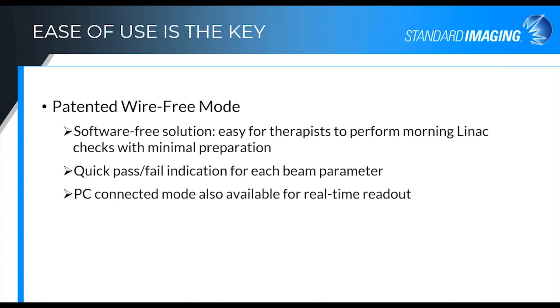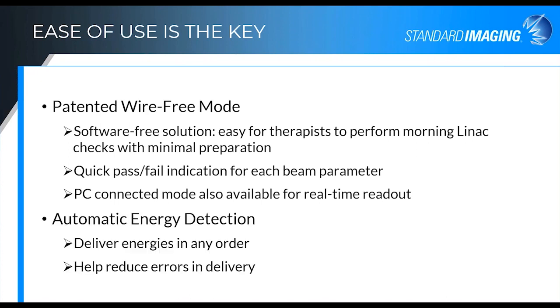If you do want a PC connection and to get real-time measurements, there is also a parallel real-time readout method, and you can use the device connected to software as well, and I'll show you a little bit more of the detail that you get with that later.